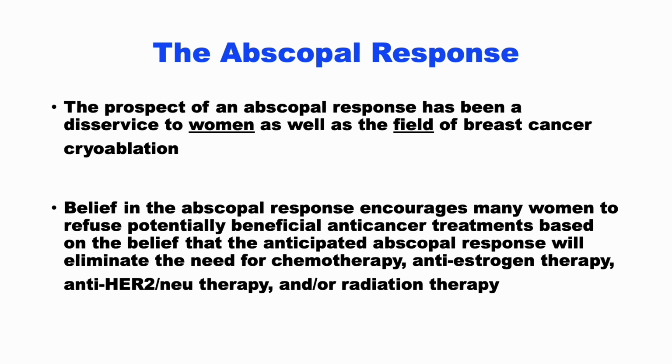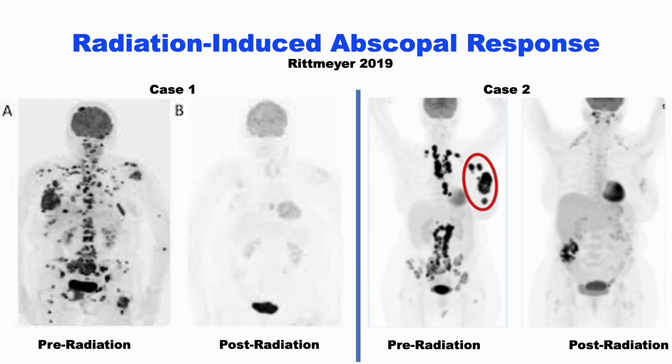And this not only harms them directly, it also undermines the confidence in cryoablation in the medical community, which can end up depriving other women the opportunity to have cryoablation in the future. In particular, the belief and or hope for an abscopal response has encouraged some women to decline radiation therapy, which in many cases leaves them with a higher risk of recurrence.